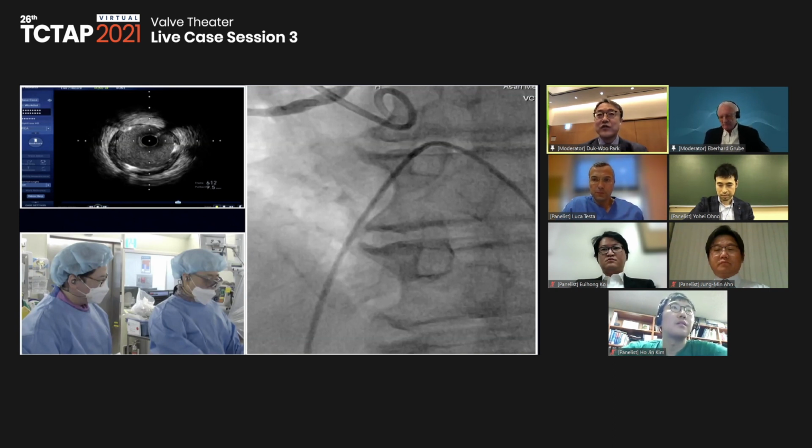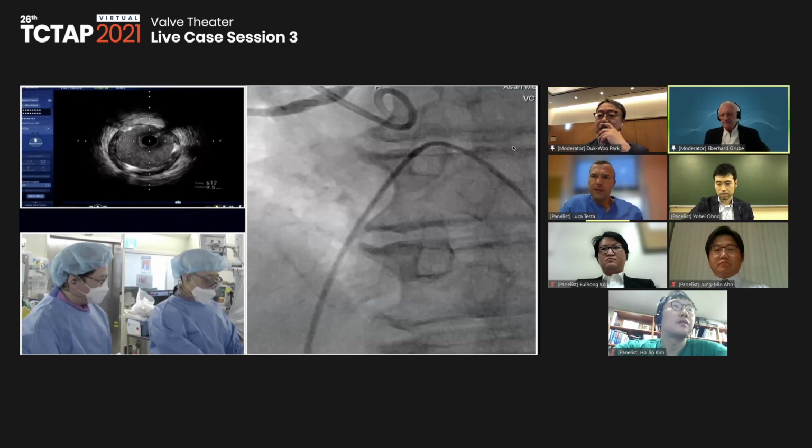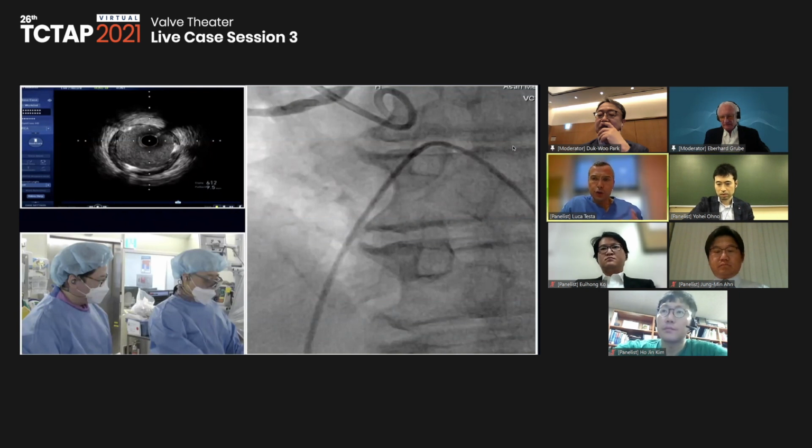And Dr. Luca, you commented that you routinely do coronary angio and even check the CTA, and that was your routine practice. What we do is, in one single shot, we do the CT scan, gated for the EKG.